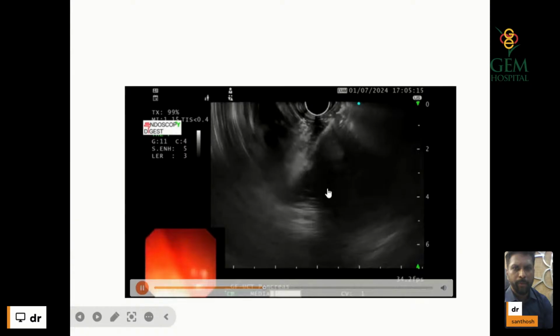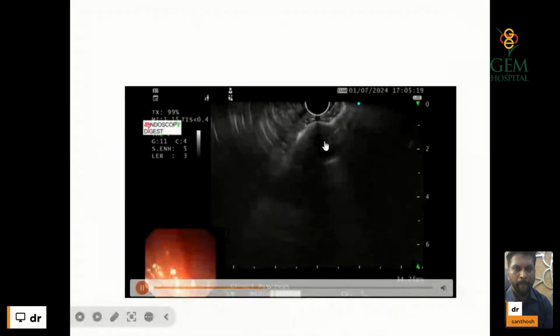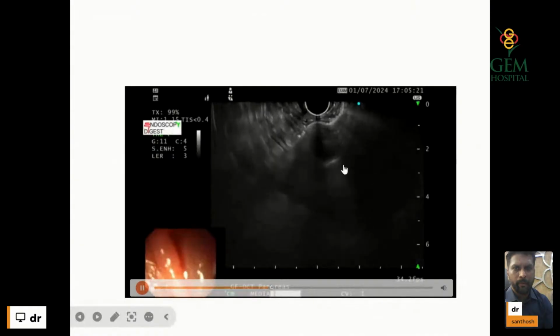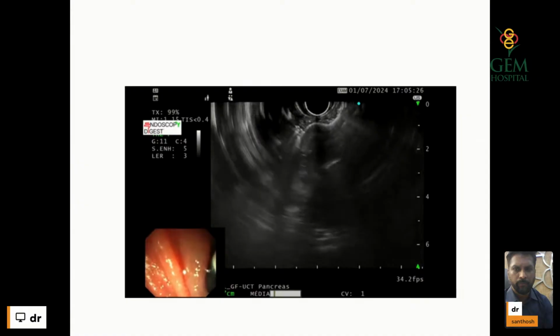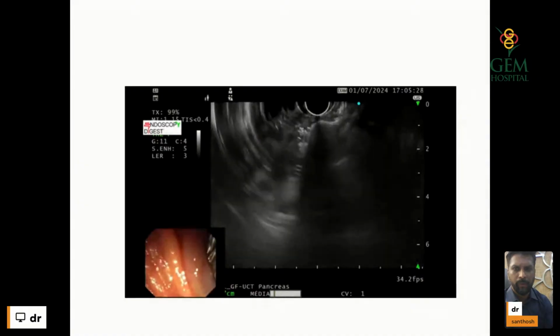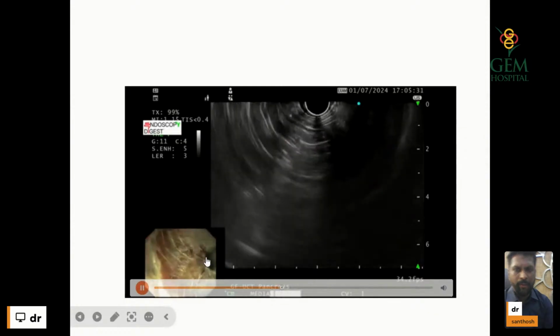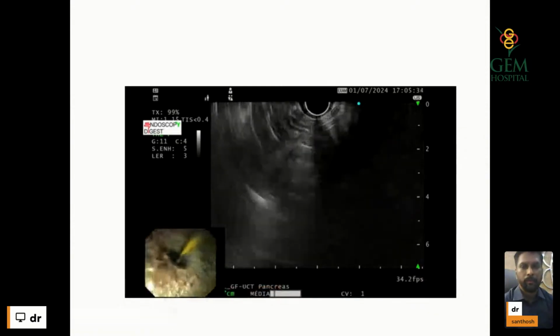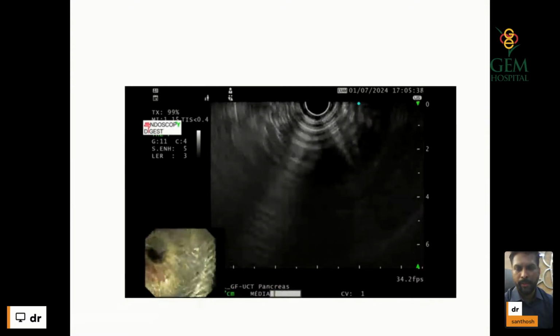Open the LAMS. This is the distal flange, followed by release of the proximal flange. This is the LAMS placed from the proximal pouch into the distal excluded stomach.